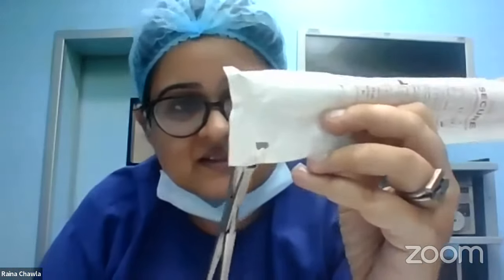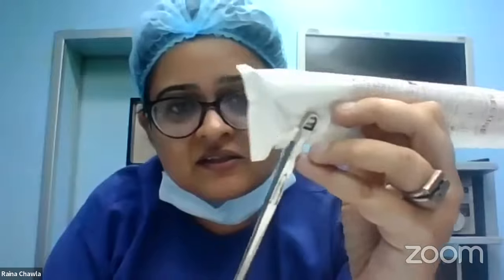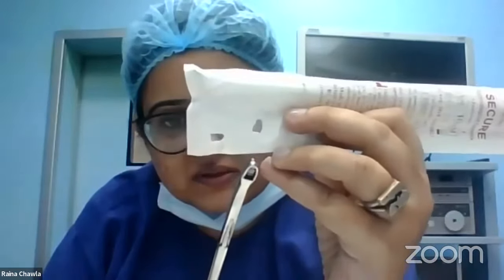Okay, so this basically has fine blades there. And when you take the biopsy, it creates sort of a punched out lesion. Can you see this? I took a biopsy of this and the blades have nicely cut through. So that's how it works, it's like a punch.